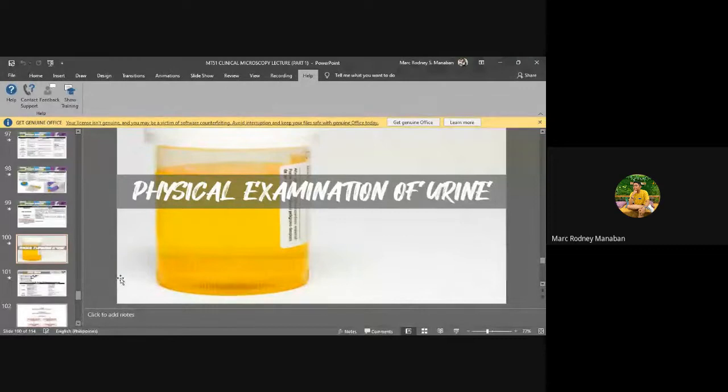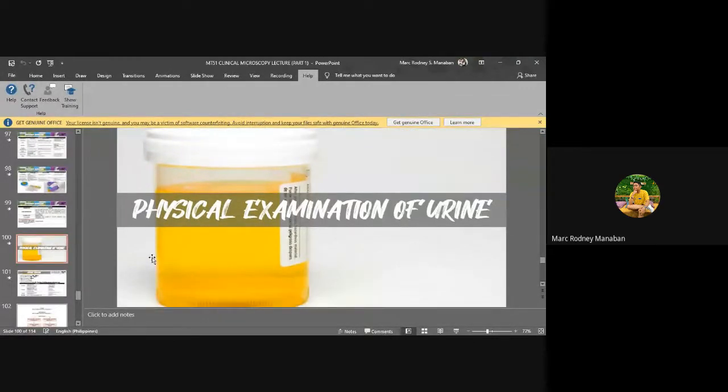Sorry. Anyway, so we'll start with physical exam, di ba? So as I mentioned, I have to emphasize, dears, that kaning stages ninyo sa urinalysis, these are all interrelated with one another. Okay? You have to correlate between physical and chemical and microscopic, silang tanan gyud. So kung unsay physical, dapat inani po ako makitan sa chemical. If kaniyang chemical, unsa akong makitan dapat sa microscopic. And if kaniyang microscopic, unsa dapat yung appearance sa physical. Okay? So they're all interconnected. Lahat sila ay magkakaugnay. Alright? You should correlate it with one another. Alright? I have to emphasize that.